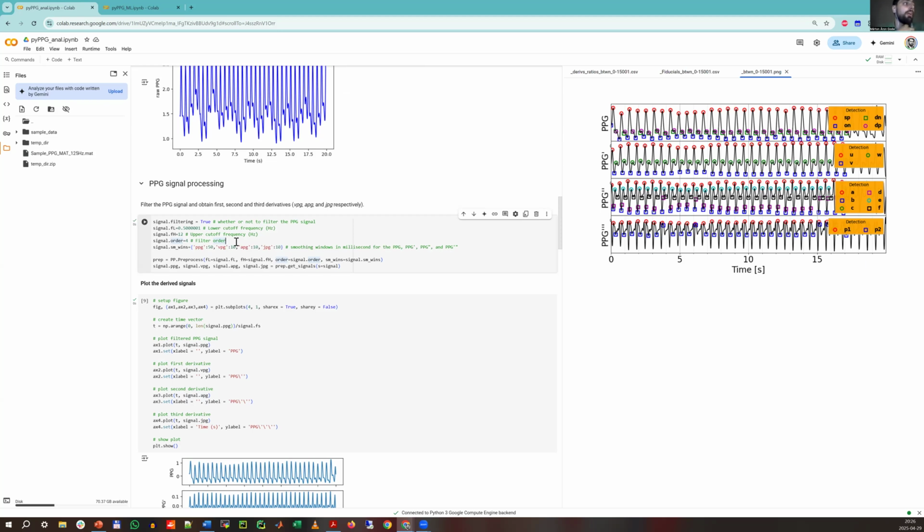One of the good points of the IIR filter is that the complexity is much less. On the other hand, it can be unstable. So that's why we use this specific cutoff frequency, because it was stable for each validated signal.